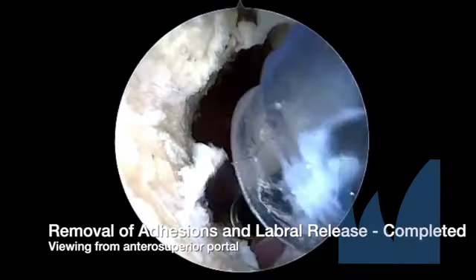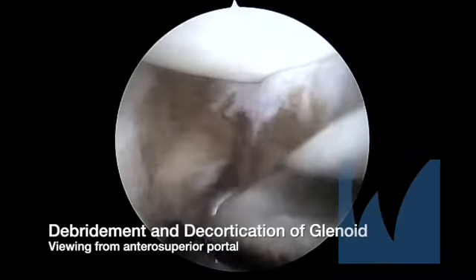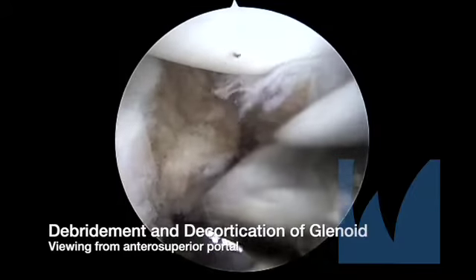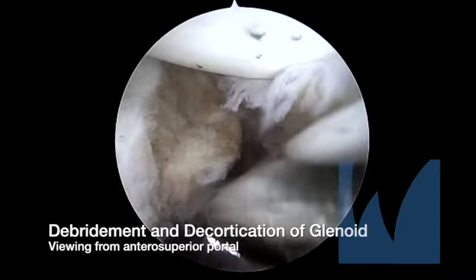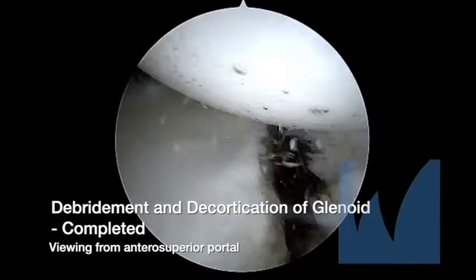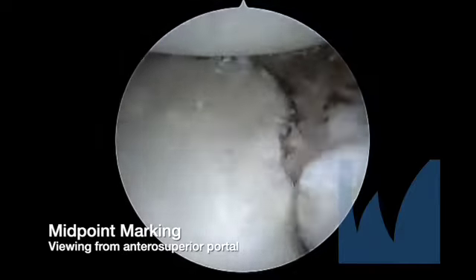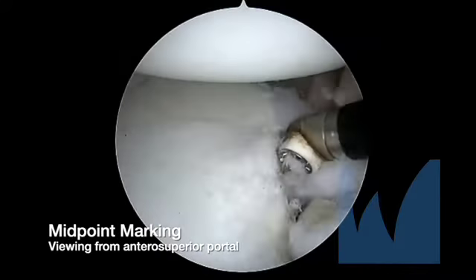It is important to release everything between the labrum and glenoid neck so that the muscle belly of the subscapularis can be clearly seen. A burr is used to decorticate the anterior rim of the glenoid, creating a perpendicular surface with minimal ridges and visible bleeding cancellous bone. Here we can see the decorticated anterior glenoid rim forming a perpendicular surface with the articular surface of the glenoid. The midpoint of the decorticated rim is then marked to inform subsequent tunnel placement and graft alignment.